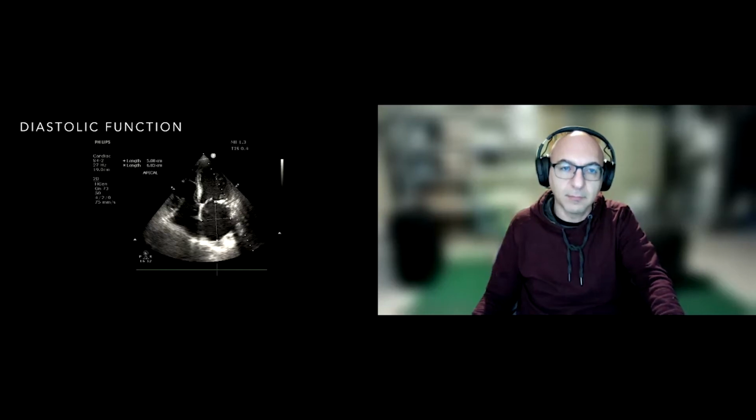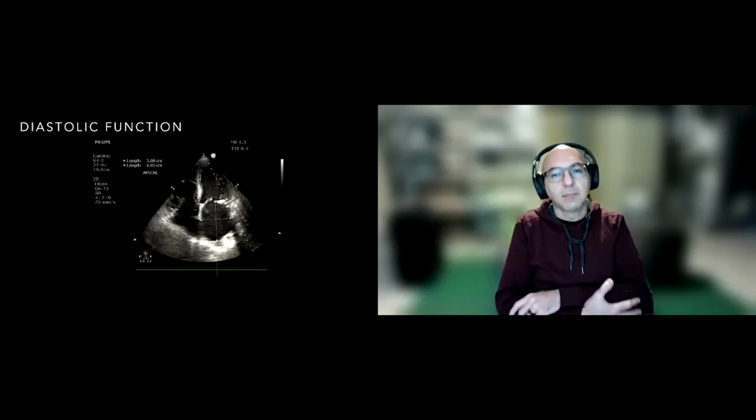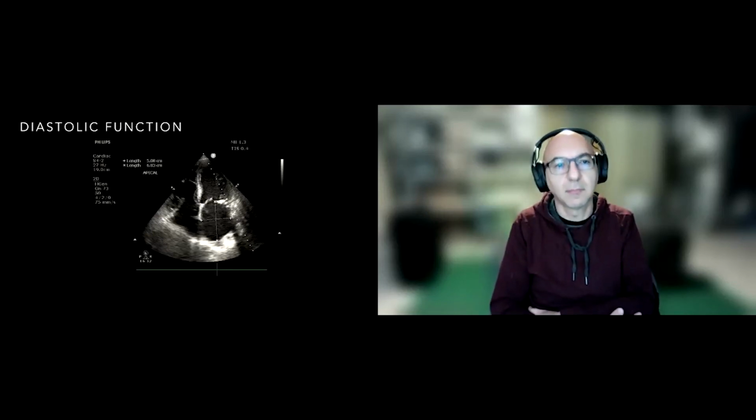And to me, I interpret this as saying, hey, we have some form of dysfunction here. We're looking at severe diastolic dysfunction, which is then causing some volume and pressure back up into the left atrium. So just looking at it, I'm going to say your left ventricular end diastolic pressure is probably going to be a little on the high side, as we go into some further quantitative assessment. But anything you wanted to add before I go on to the next slide, Z?